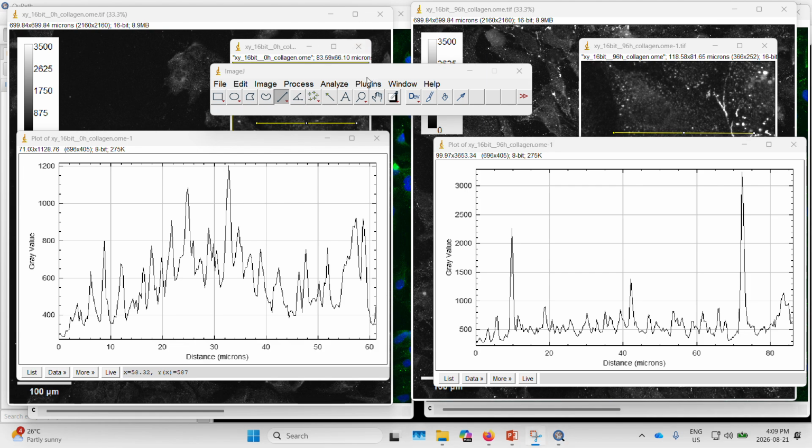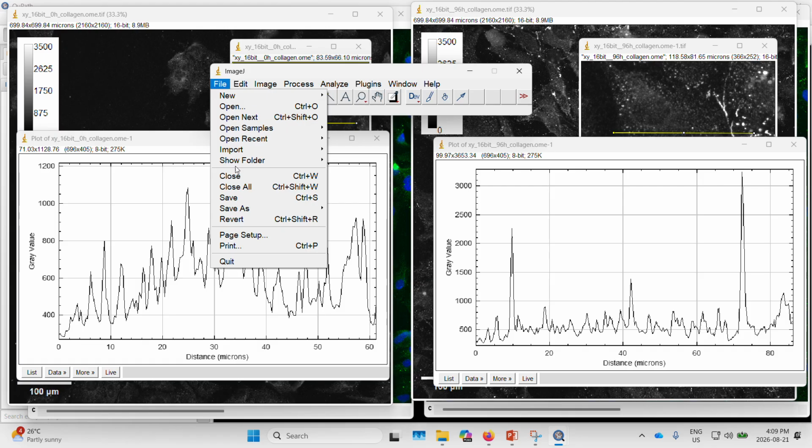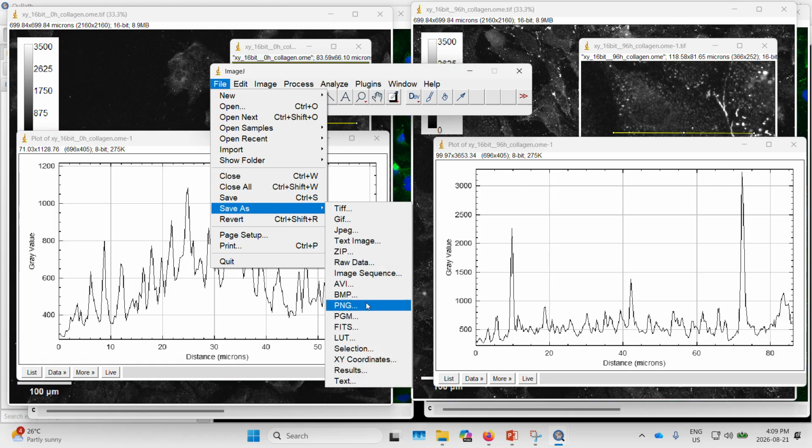Now in the instructions, we have the BioVoxxel Figure Toolbox plugin as part of our ImageJ. In our situation, as we're using ImageJ that's in QuPath, we can simply save all of our outputs as one of the other image file formats. For presentation, I would recommend PNG.